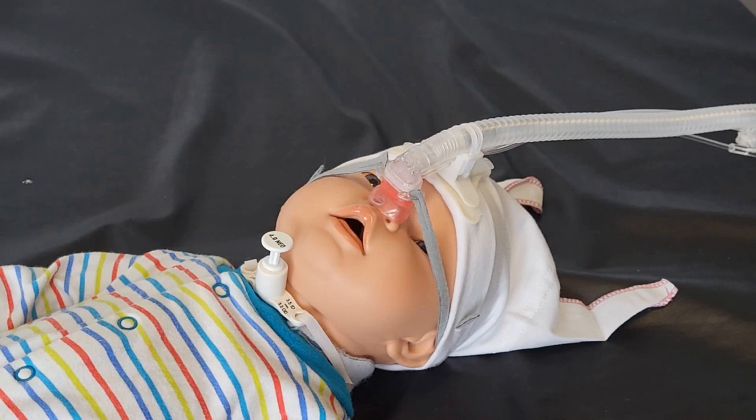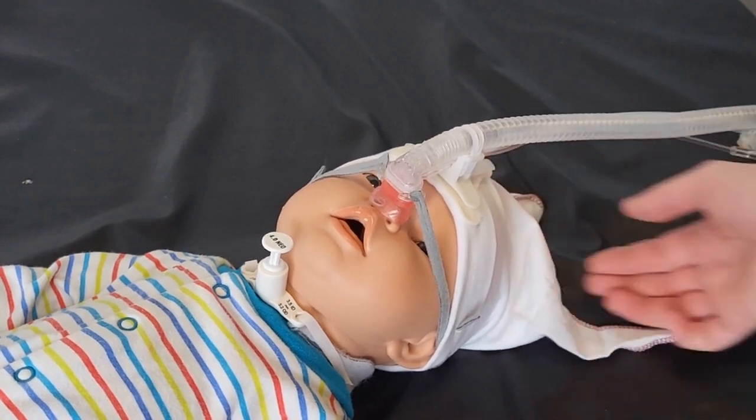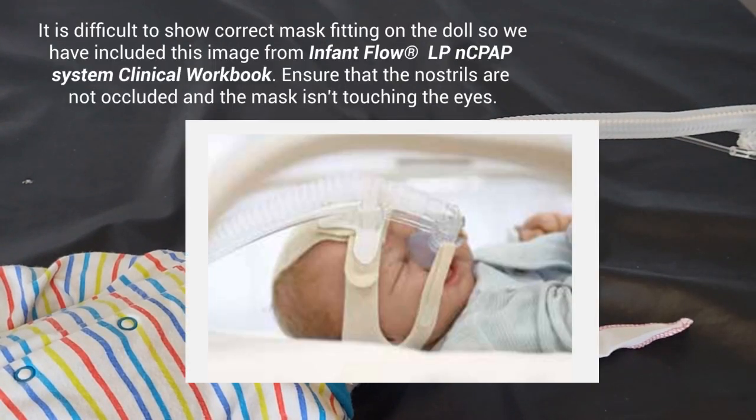We should be alternating between the nasal prong and the nasal masks four to six hourly to relieve pressure. We should be doing checks on the ears to make sure they're not folded over or getting too dented by the straps — in which case we can move the strap up or down slightly — and checking the foreheads and behind the head, as the patients won't be moving very much. Where possible, we should avoid NG tubes as they can affect the seal, and an OG tube may be preferable. If using an OG, always check the centimetres at the mouth as it's more wet and more mobile than an NG tube. An NG tube might be better on an older baby as an OG tube could affect the tongue movement.